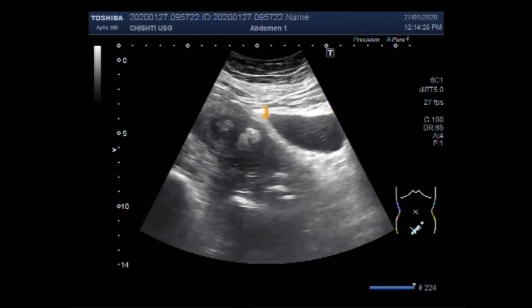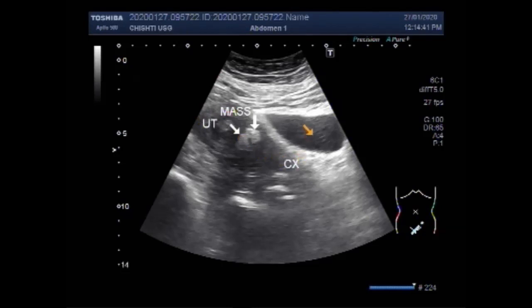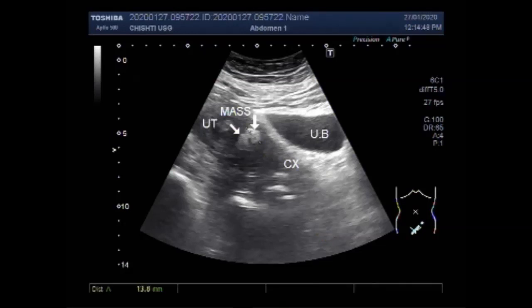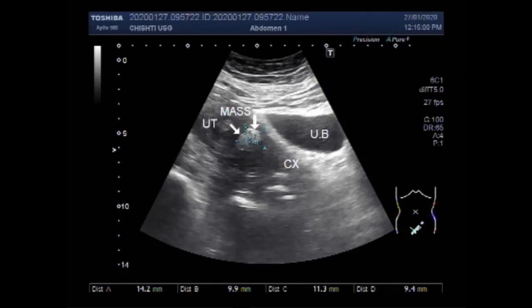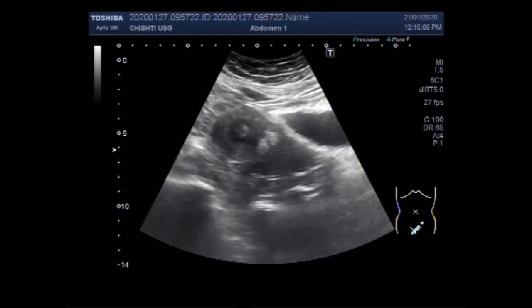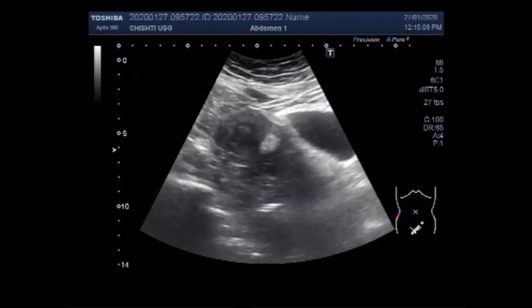These are two small masses and they are old masses, having some calcified tissue in their interior. One mass measures about 14.2 mm by 9.9 mm and the other measures about 11.3 mm by 9.4 mm. Both masses have some calcified tissue in their interior.